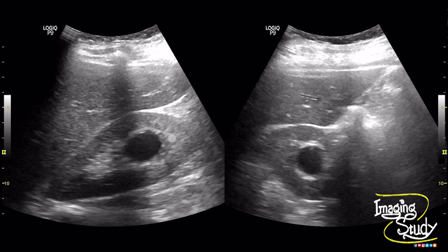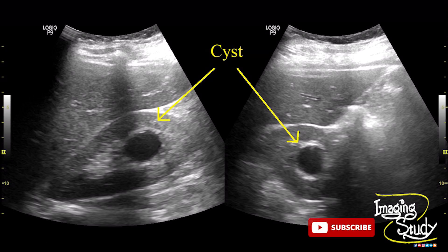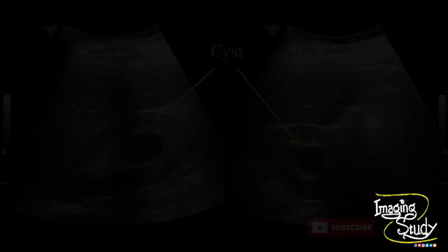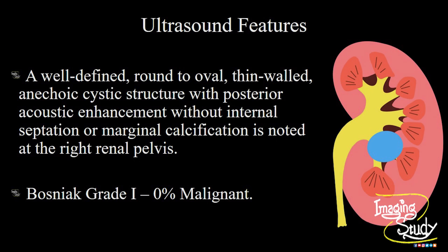Here are the longitudinal and transverse sections of this renal parapelvic cyst. In summary, a well-defined round to oval thin-walled anechoic cystic structure with posterior acoustic enhancement and without any internal septation is noted at the right renal pelvis. According to these findings, this cyst is Bosniak Grade 1, which suggests no chance of malignancy.